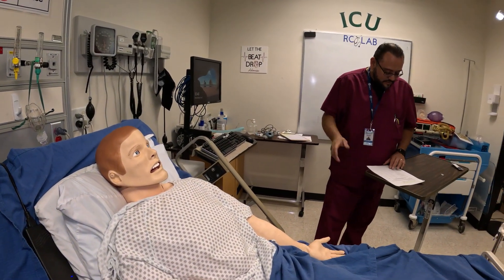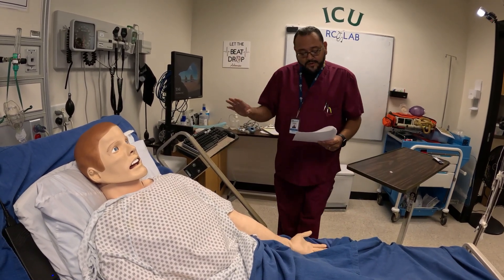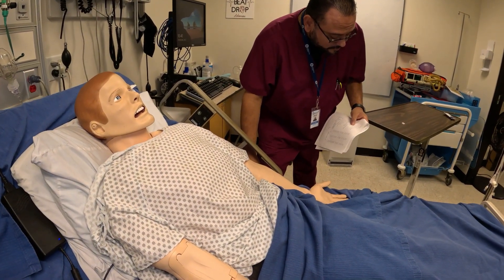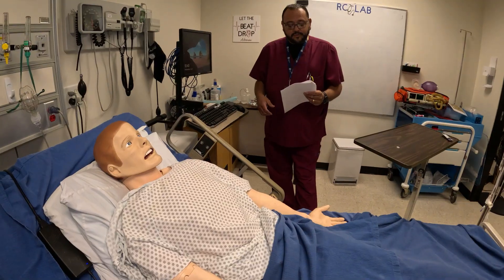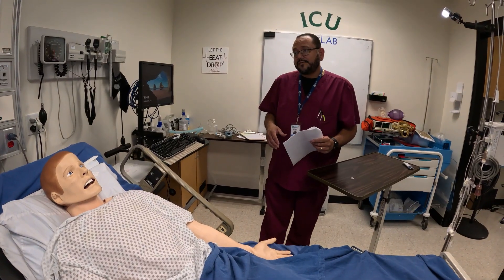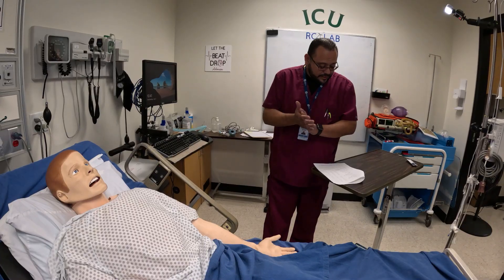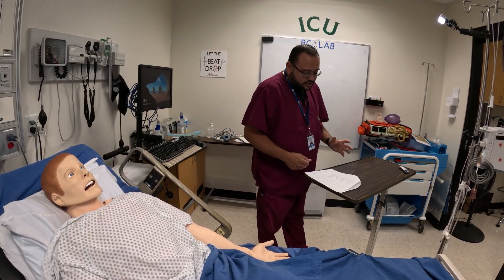After that, we do our post-vitals. And if Mr. Smith would like to go back to his previous position, we would do that. Mr. Smith, would you like me to lay it back down? I'll lean it back down a little bit more for you — tell me when to stop. When the patient is doing his treatment and everything, just encourage them to breathe, encourage them to cough. Make sure you're monitoring for everything — if you see any adverse effects, like if his heart rate starts going too high, you would want to stop the treatment and make a note of that. After the treatment is done, I'm going to clean my hands, clean up my mess, go document everything, and chart everything.